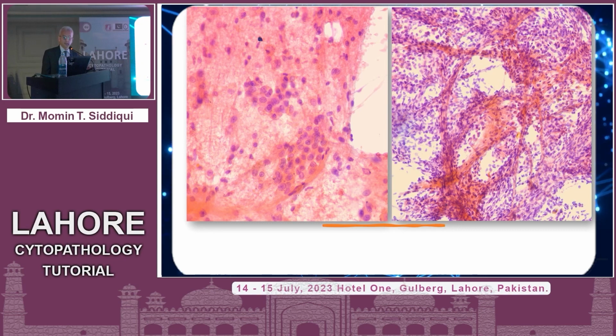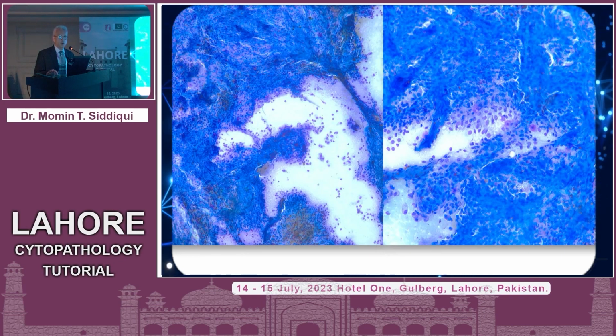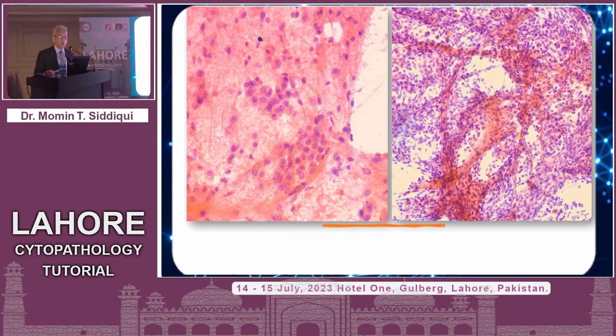This presented as a large lesion. It came to the consensus conference. I honed in on the fact that please consider this as a negative call, and basically recommend this to be followed up as a medical process and call it representing resolving pneumonia. So this was actually called out as atypical because for some reason that individual wanted to not miss out on a cancer. And obviously I can't really fault anyone, because if there is an adjacent area which looks angulated and speculated, could this be the periphery of that lesion? So again, in this case, follow-up showed basically resolving pneumonia and no cancer was detected. But be careful when you have something which looks like granulation tissue. It could just represent basically benignity and basically resolving pneumonia.